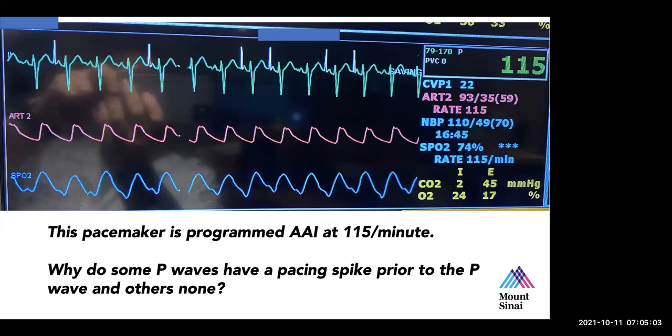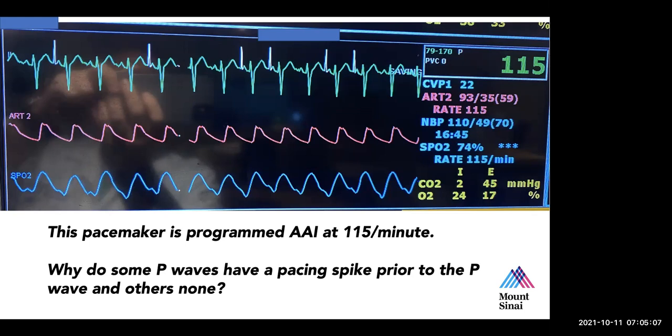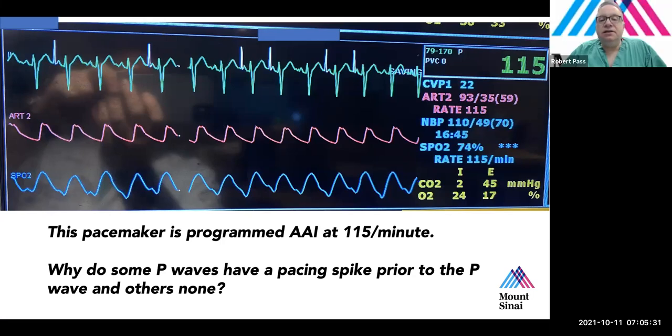It will show two light bulbs that show us when it's sensing and when it's pacing. So if I would see that the pacing bulb is going on and off with every beat, it would mean that it's pacing consistently, continuously. Exactly right. That's exactly right.